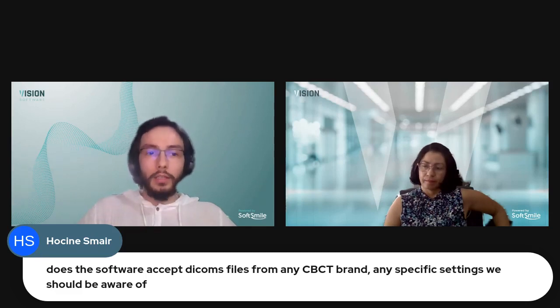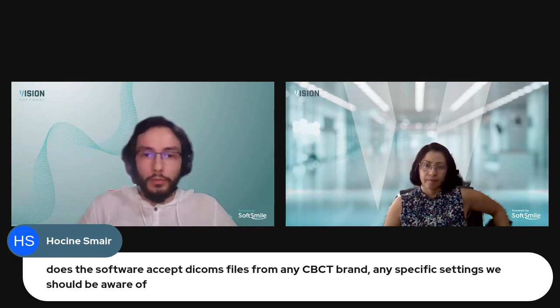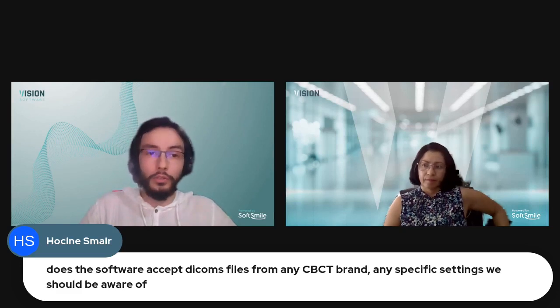That's a very good question. The industry standard is more or less defined. So I wouldn't be able to name the specific settings, but the industry standard typical orthodontic settings for contrast, for resolution, etc., just work.